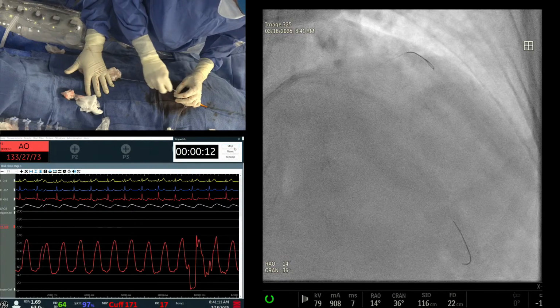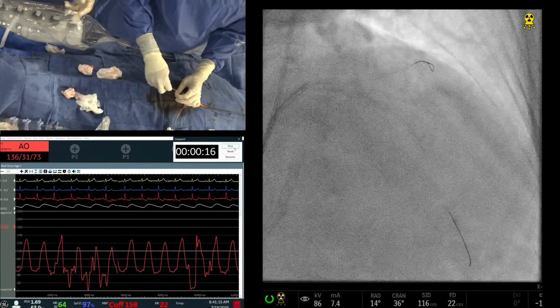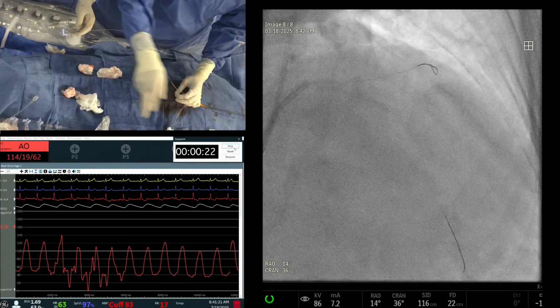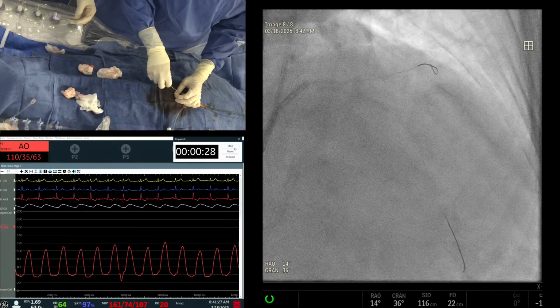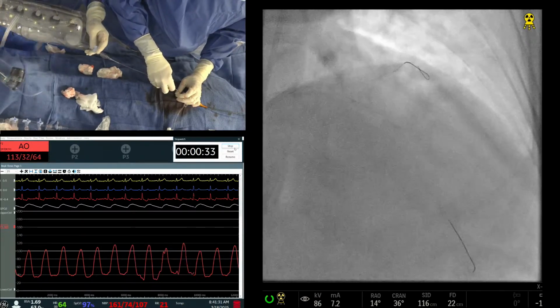Don't connect yet. We have one more interferer. Good. Why did it move to the top? Things changed upside down. Good. Okay.